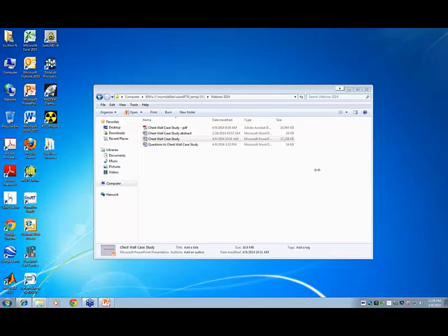Question: approximately how long does it take to plan each example you showed today? Usually with the regular chest wall case, we bring it in. It takes a little time, we do some contouring, including the wires. But once you contour out all that, get all the contours, and then of course all the fills, I would say that takes maybe 30 minutes to an hour, and then it may be another hour or so just to plan the chest wall case.